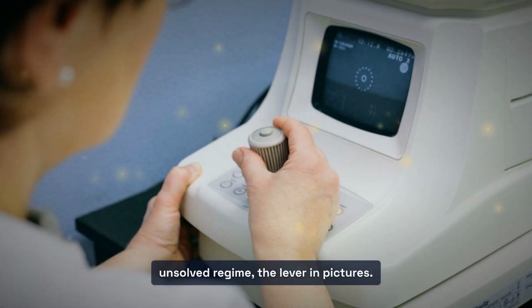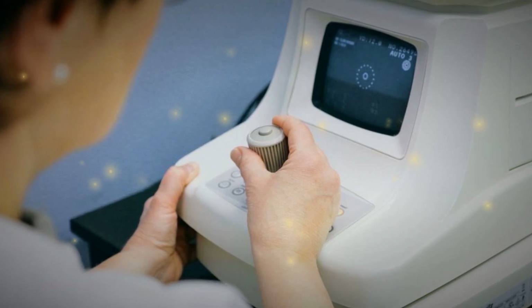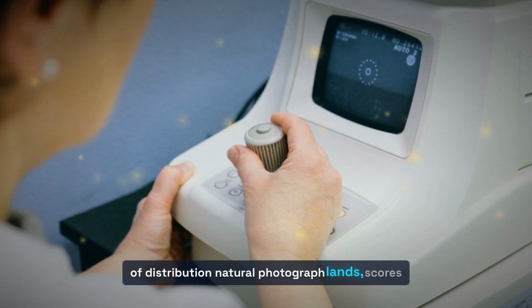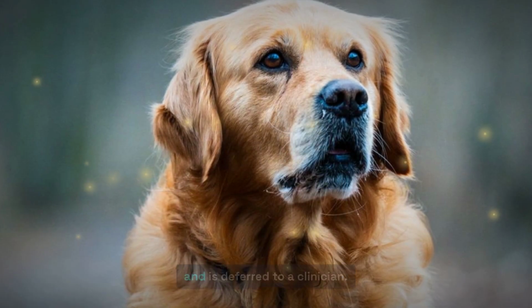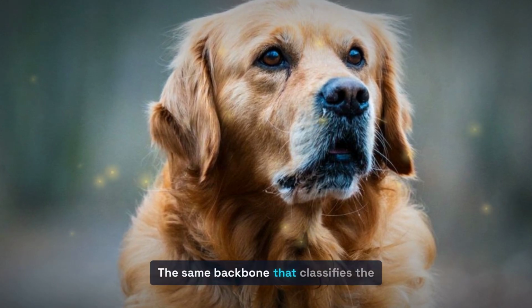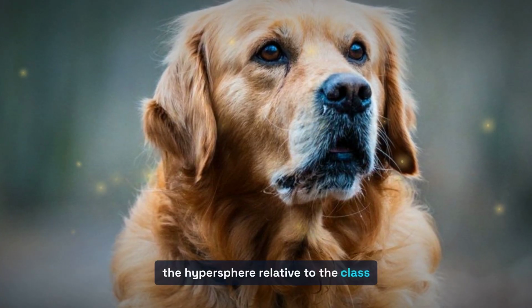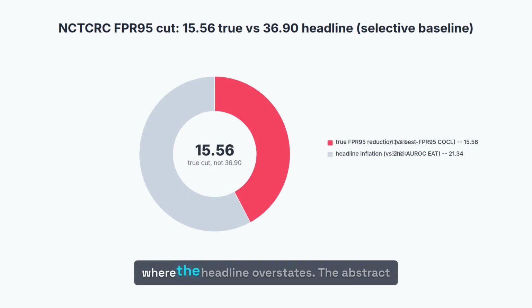The lever, in pictures. Before, an in-distribution retinal fundus image lands and is classified into a known disease class. After, an out-of-distribution natural photograph lands, scores high on the combined OOD score, and is deferred to a clinician. The same backbone that classifies the known also flags the unknown by reading where the feature lands on the hypersphere relative to the class directions and the outlier expert boundary.